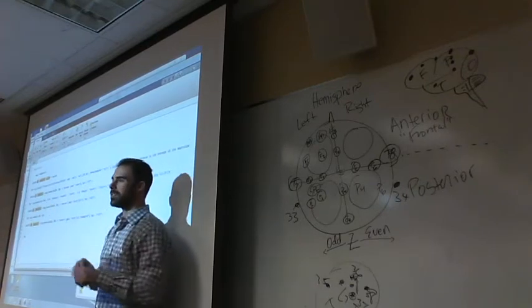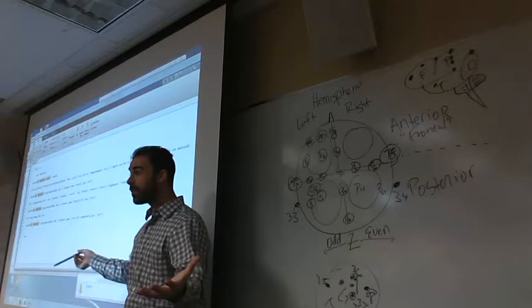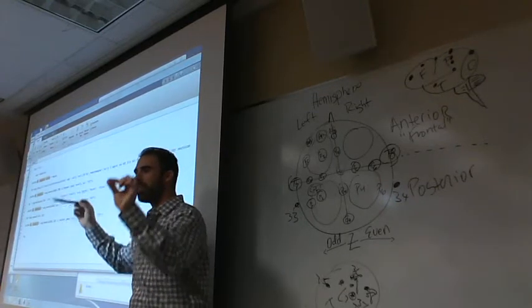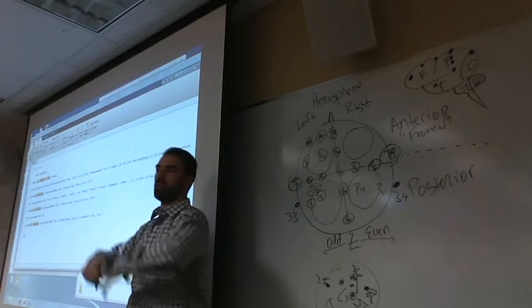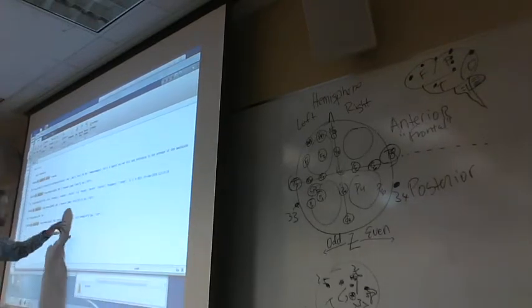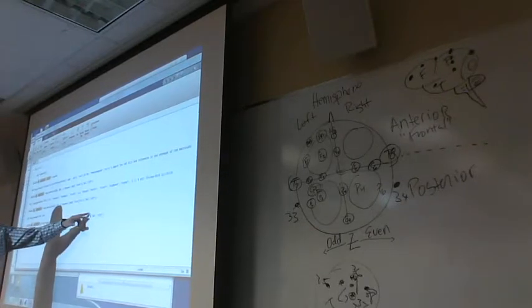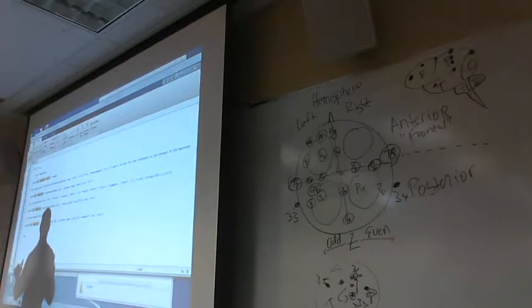And what I mean by perfect is because MATLAB is just a computer, if one thing is out of place, it could read it wrong and it just won't work. So it's important that we have these apostrophes, these brackets, these commas. They all need to be just right. Everybody on board with the idea?